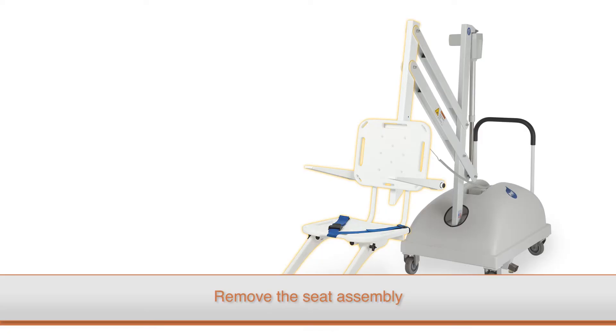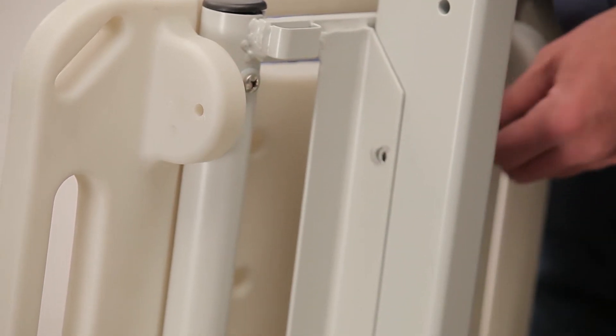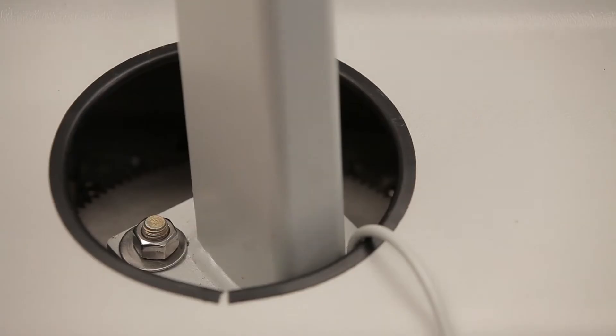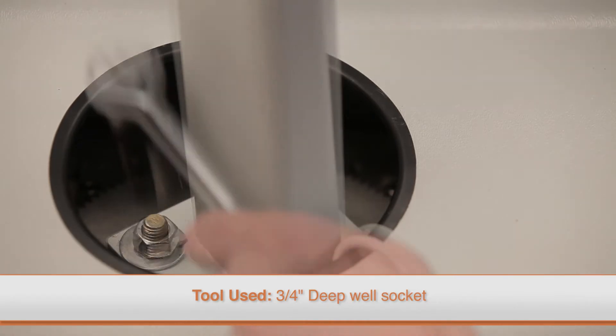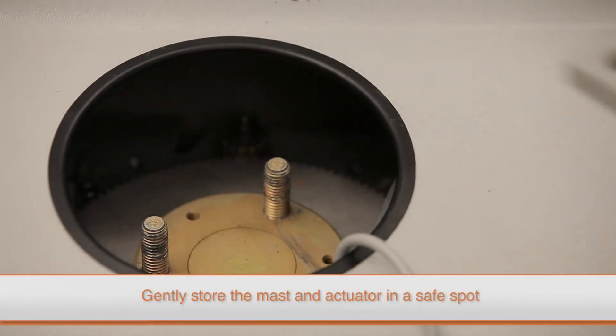On the PAL lift, you will need to remove the push bar by firmly gripping it and pulling it up until it is free from its mounting pegs. Next, remove the seat assembly by loosening the thumb nut on the bolt that attaches the seat assembly to the arm, then remove the bolt and the seat assembly. Use a deep well socket wrench to remove the nuts attaching the mast, then remove the mast assembly, being sure to place it so that the actuator arm does not get damaged.